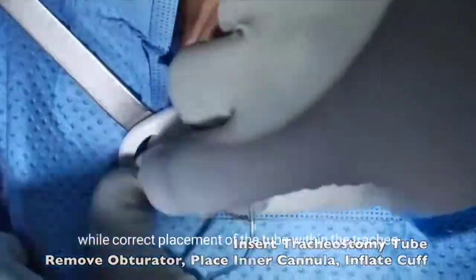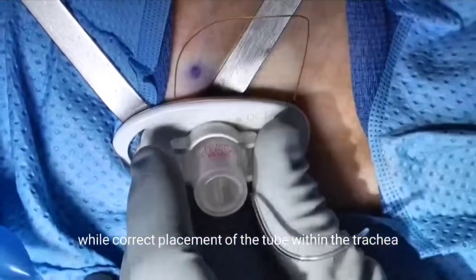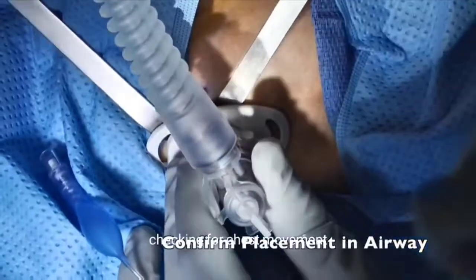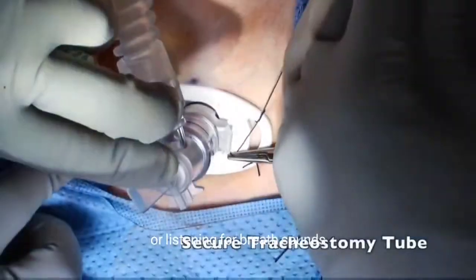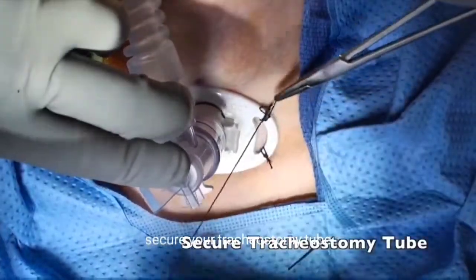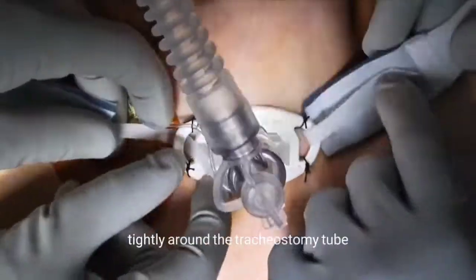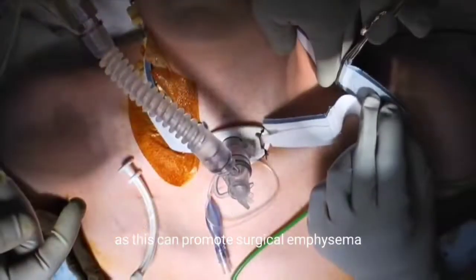Hand ventilate while correct placement of the tube within the trachea is confirmed by checking the expired carbon dioxide, checking for chest movement, or listening for breath sounds. Secure tracheostomy tube and do not suture the skin tightly around the tracheostomy tube, as this can promote surgical emphysema.